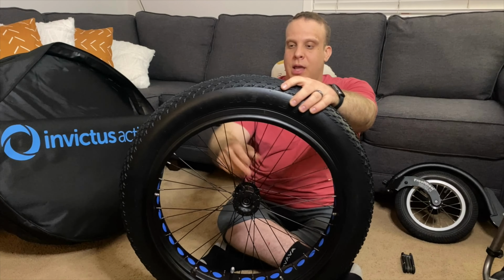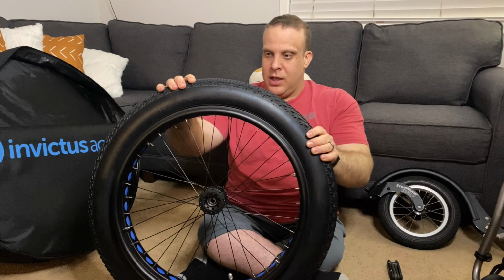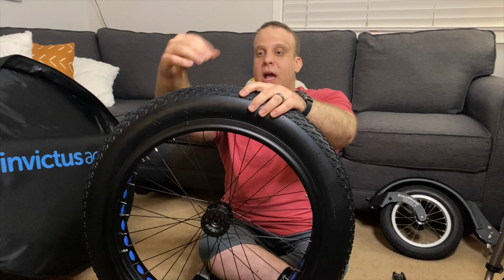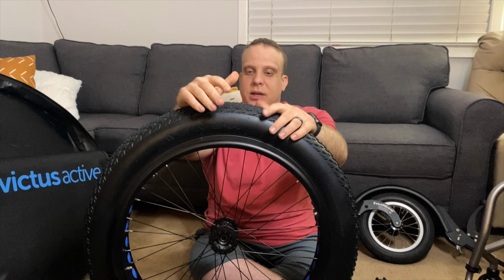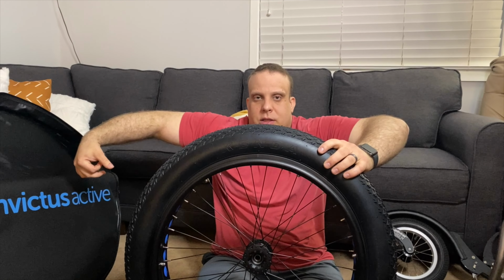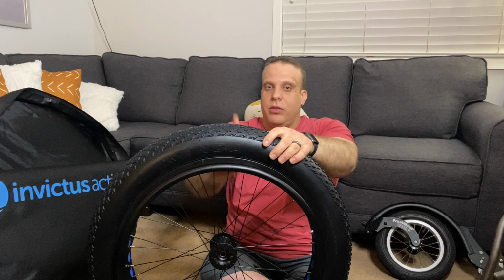They're not metal. I don't think they're metal. I think they're like Spinergy spokes, but thinner. They might be metal, but anyways. So these are a lot lighter, first of all. Another difference from the other ones is that they're not quite as wide, which I'm okay with because I think that will be easier on my shoulders when I'm pushing too. I'm not out here pushing like this. I'm a little bit closer to my normal mechanics when pushing. They are taller this way though.